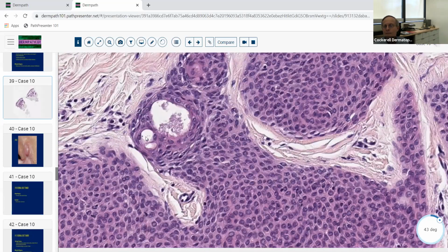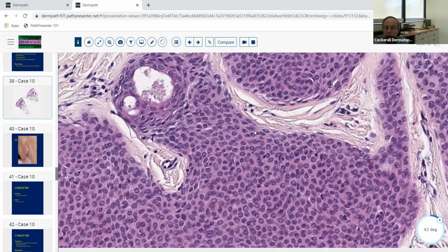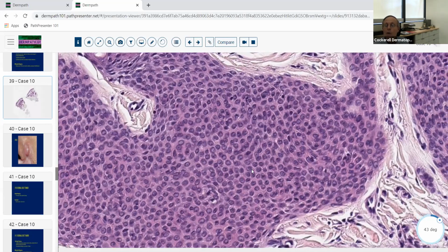Ductal just means that there's evidence of a small duct in the lesion, like an epithelial-lined ductal structure like over here. But these are not ductal. These are more coming from a structure of a gland that is associated with ducts. But when you see individual cells that are very monomorphous, we refer to that as poroid differentiation. And that's thought to be eccrine differentiation. This is a variant of eccrine differentiation.